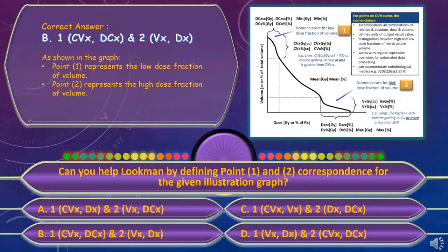For example, some of the head and neck cases require estimation of dose on constrictors, but it is just a small number of cases. But in this case of preventing doctors creating their own structures, physicists are obliged to create it in advance for all the cases. Yeah. So is it time saving in overall of your experience?